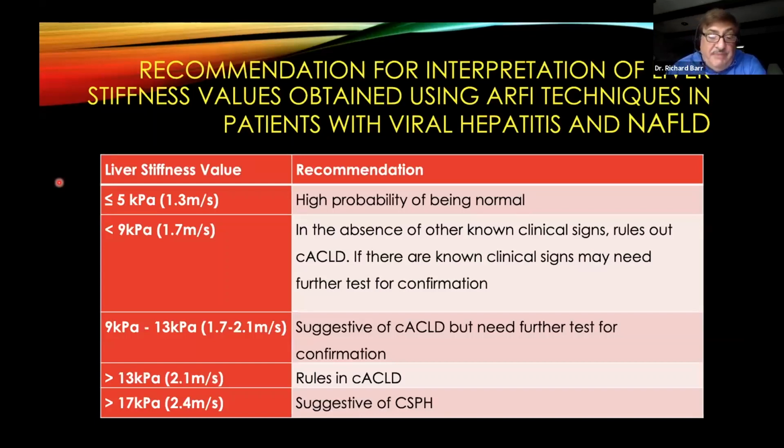You'll notice that we dropped the higher cutoff value to 13 because now we're including more F3s, because again, those Metavir F3 people are also at risk for the complications.